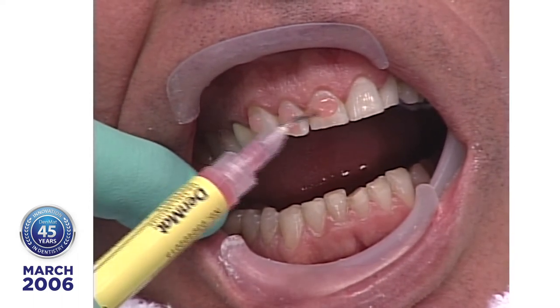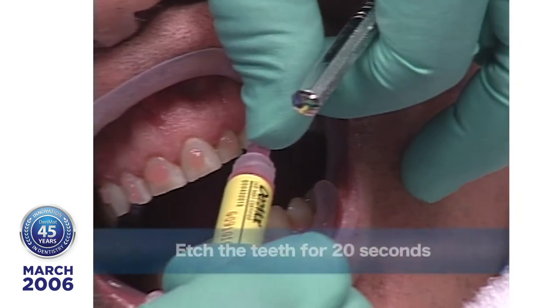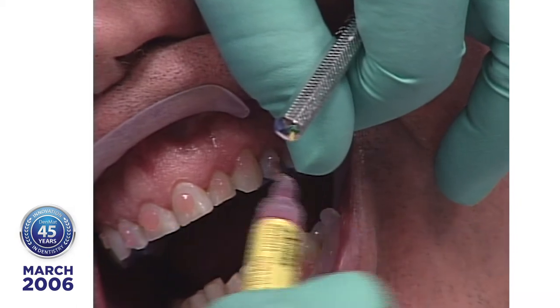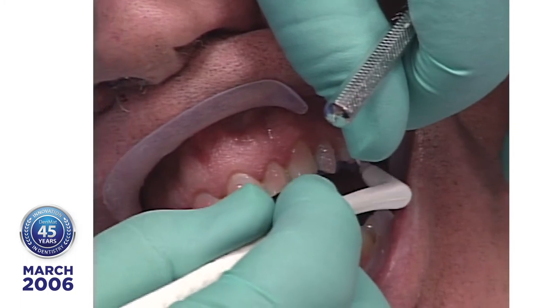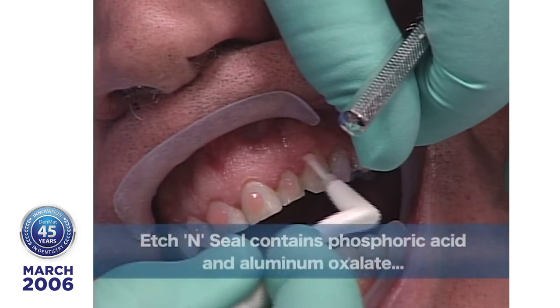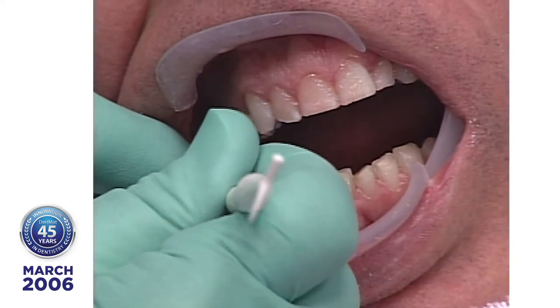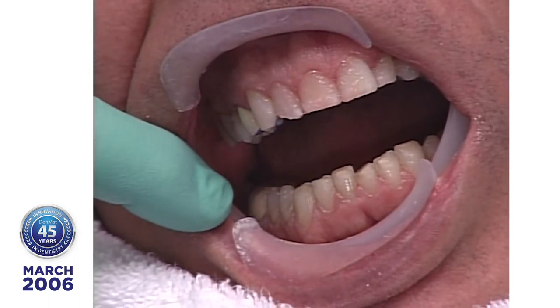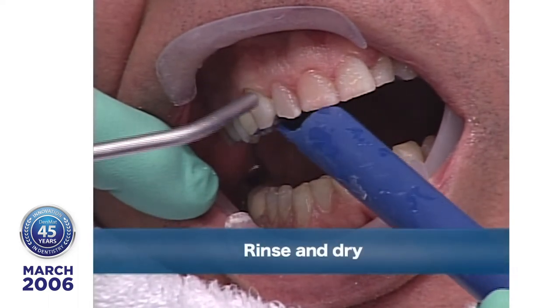And on the natural teeth, I'm using Etch and Seal, medium viscosity. So the citric acid is being applied to the porcelain, and the phosphoric acid is being applied to the natural tooth, the calcium. I like to use Etch and Seal because it contains aluminum oxalate. And if you get phosphoric acid on dentin, the aluminum oxalate will seal the tubules. So we leave that on for about 20 seconds and then we wash it off. Okay.